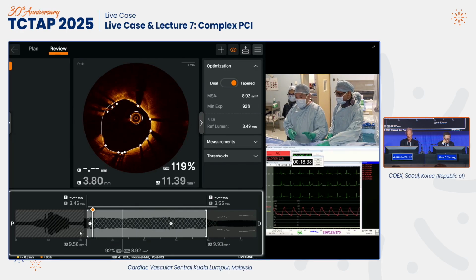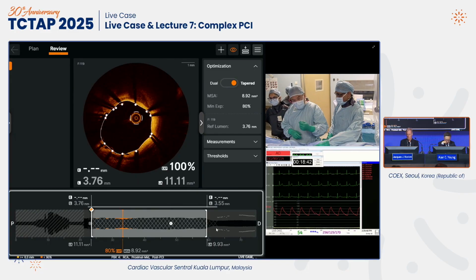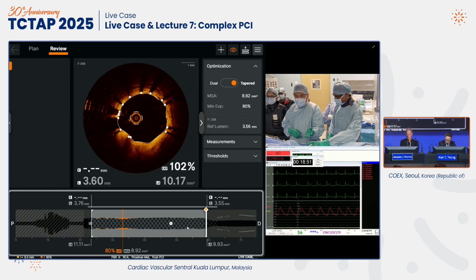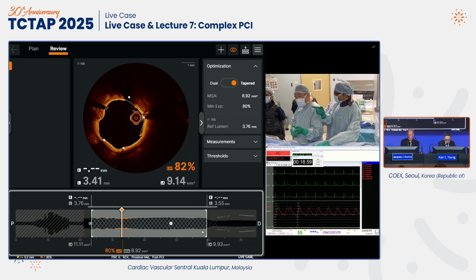It is less bulky than IVL. And even after you dilate, you can recross again. You just need to dilate with a 2.0. In our case, there was some resistance. We went with a 2.5 balloon, and then we could get it through easily. In fact, we tested it just now. We wanted to show you that when we pull out and push in with the used balloon, it still went in.